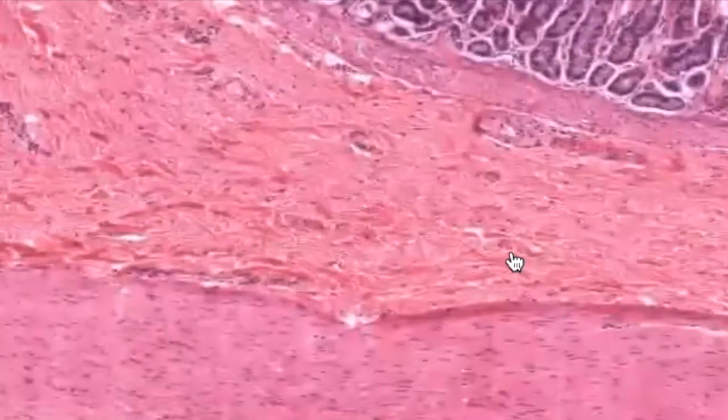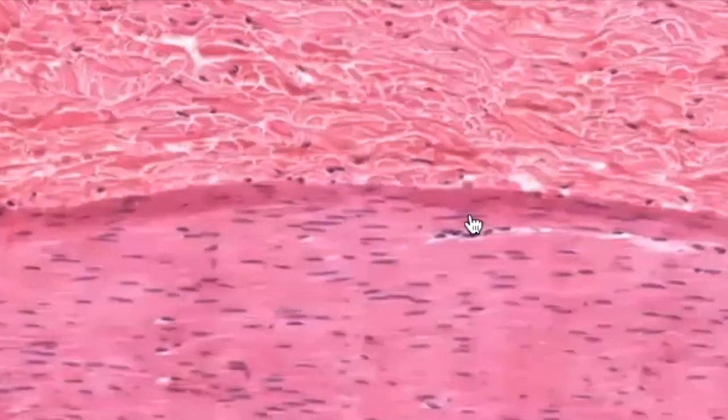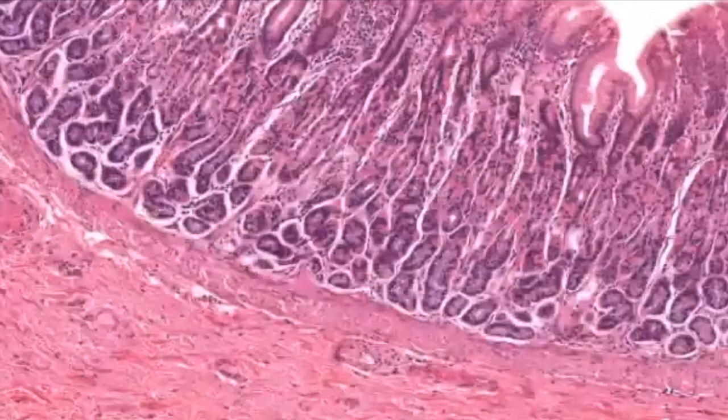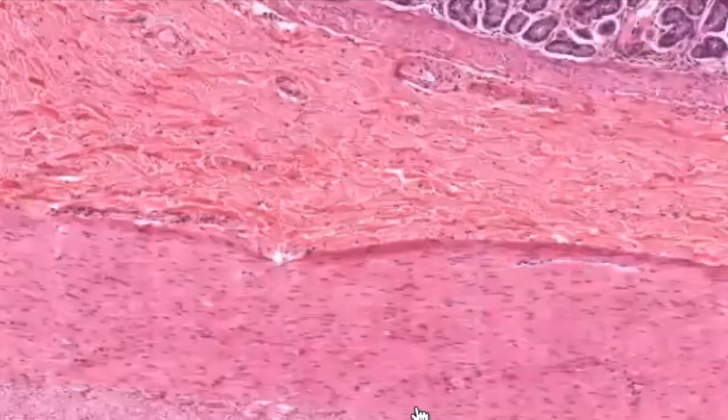Okay, and then move the transition from the submucosa. Again, you want to be able to recognize the transition from that dense, irregular connective tissue to a smooth muscle. Can everybody see that? Kind of the trend. There's something different about this. These two layers, like if I had a marking right here to here, and you knew that this was the lumen, then you know that this is the submucosa, and this is where you get to the muscular layer, right?